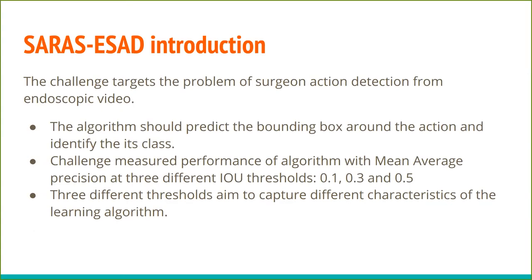So first of all, I would like to introduce this challenge. In this challenge, the task, as the name suggests, was to identify the actions that are being performed by a surgeon using the video from the endoscope. The video that we are using is RGB video. And the task is to localize the action and then identify what kind of action the surgeon is performing.